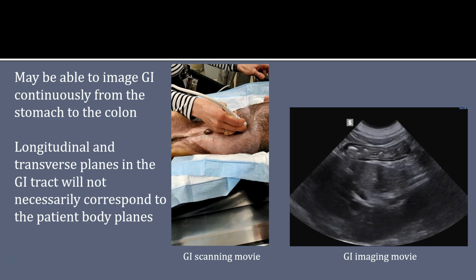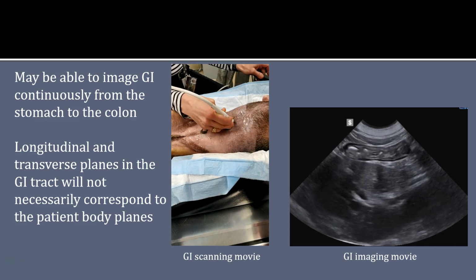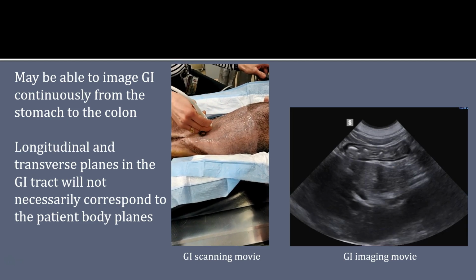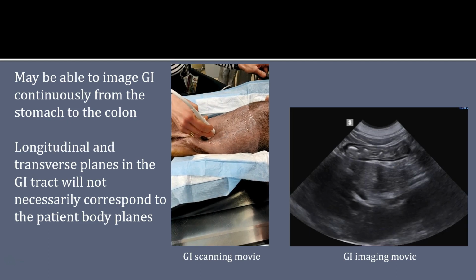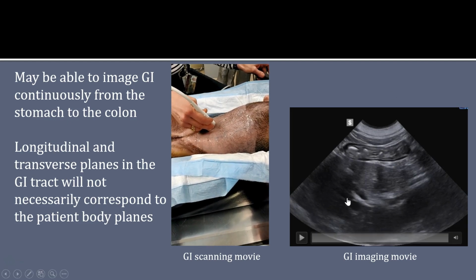descending duodenum. Then I come across into the ascending duodenum. Now, my longitudinal and transverse planes in the GI tract will not necessarily correspond to the body patient planes. Now you can see I have to move in many different directions trying to follow all of those jejunal segments as they just kind of lazily curve around in the belly there.